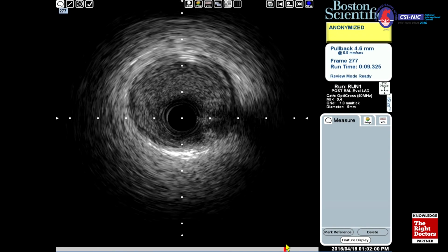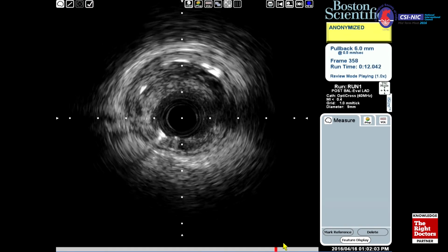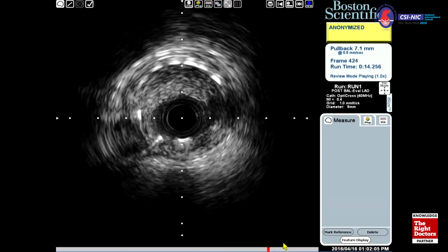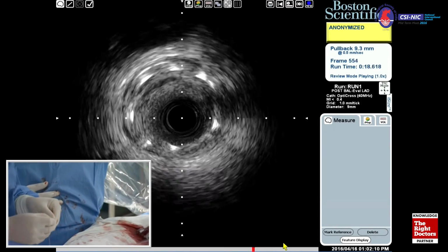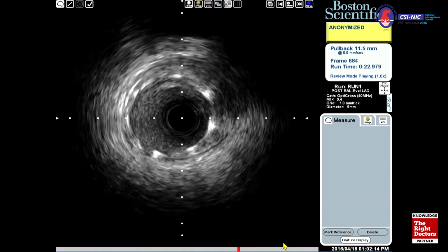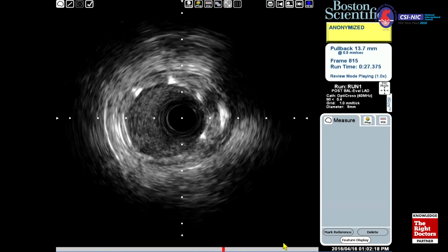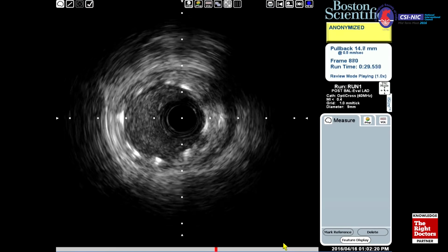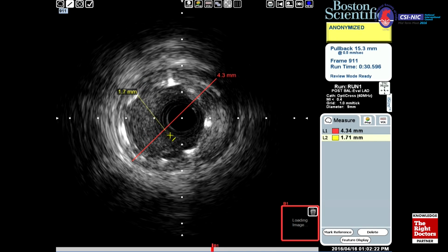All right, stented area. Distal landing area, very much intima hyperplasia. Stent diameter is almost 2.5, more than 2.5. Lumen area is at least 5 square millimeters or so. If you look at the media-to-media vessel size, it's quite big, more than 3.5. However, stent diameter is 3.0. That is almost 4 media to media.